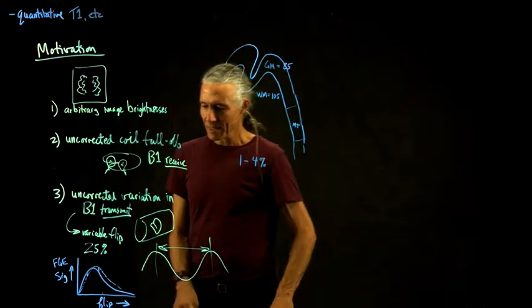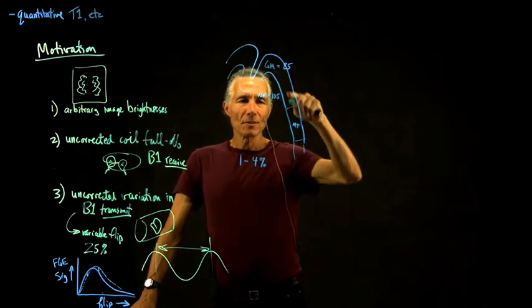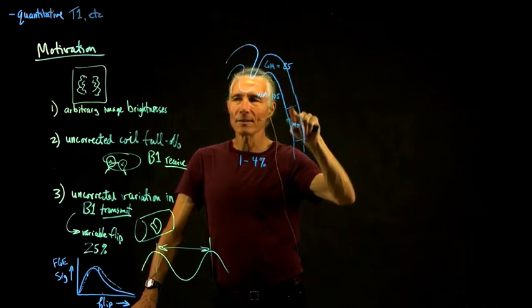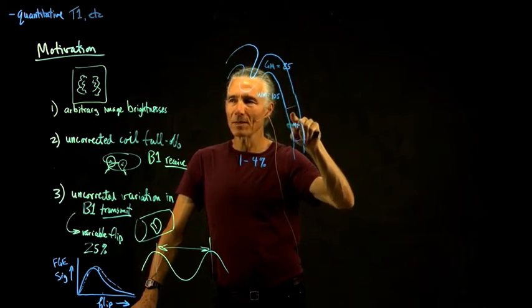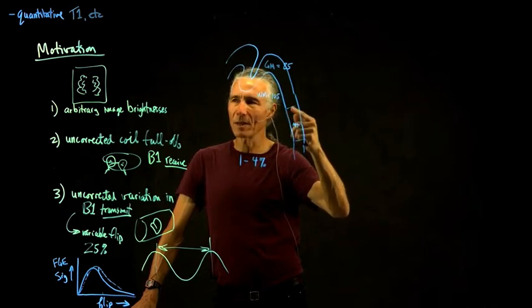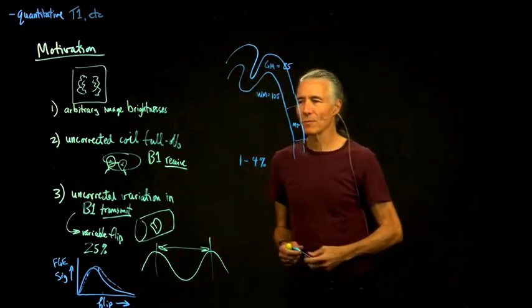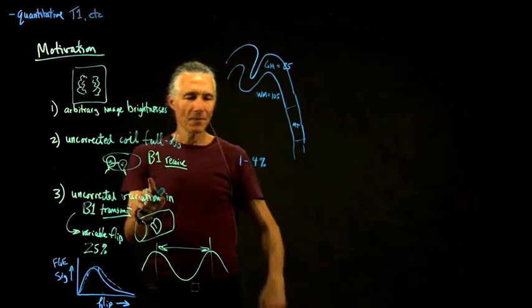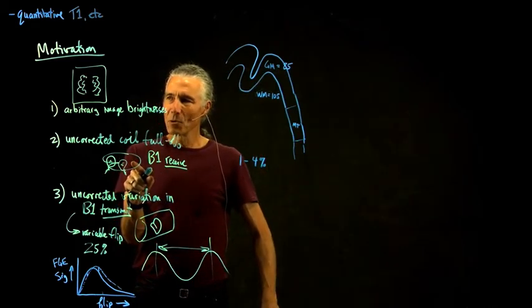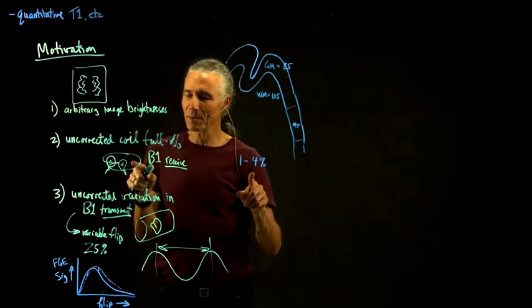So MT might be 4% more myelinated than the least myelinated part of the brain. So if we wanted to, for instance, measure the T1 values and then try to distinguish different areas on the basis of their T1 values, because those are going to be affected by the amount of myelination, so that we could, for instance, find areas. We're dealing with this very small difference, while the receive field is going up by a factor of 200%. Here we're looking for a 1 to 4% difference.